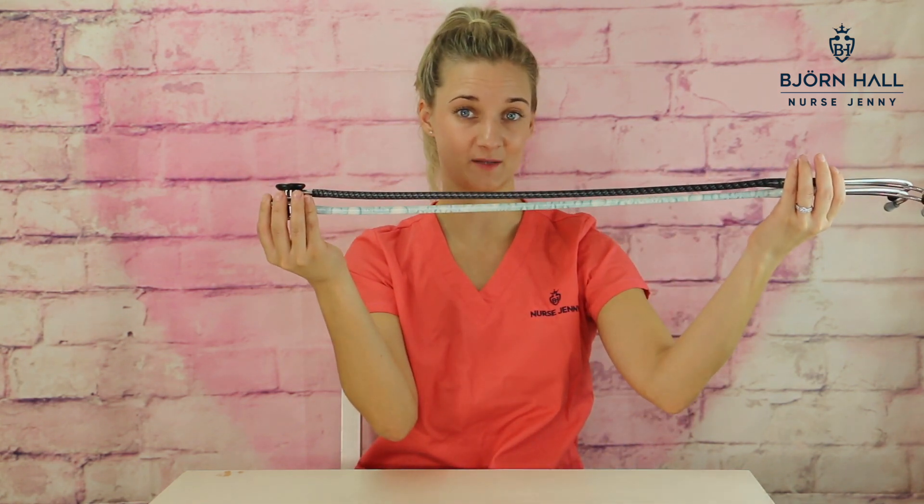Tubing length. The tubing length of the AdScope 603 and the 608 are exactly the same — they are 77 centimeters, which is 30 inches. Tubing feel. These two stethoscopes have exactly the same tubing. I find it a little bit sticky and it gets caught on my neck hair.